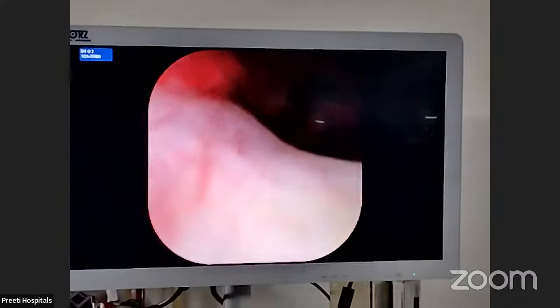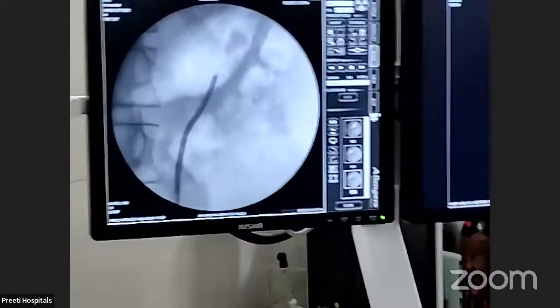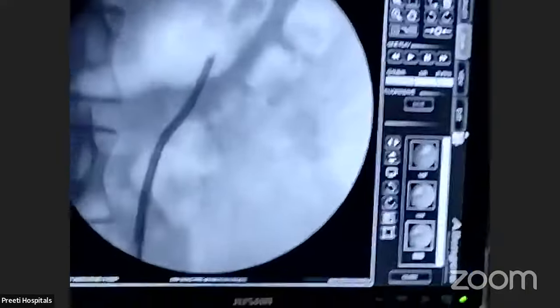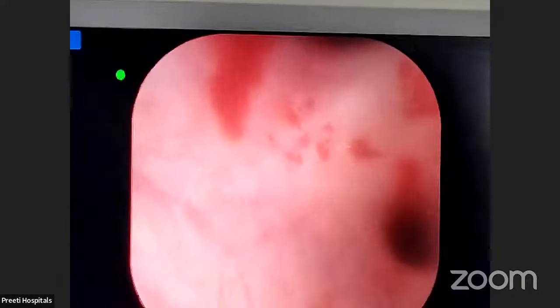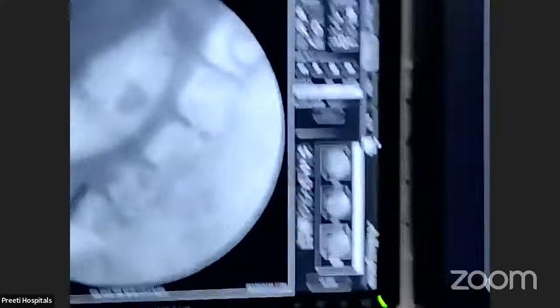Let us see how we can come up. Can you see where I am? If the sheath, where is the sheath? We have to see now. So I am coming back. This is the sheath. If I travel this much extra distance, I can do it. So I will try. Hold it. He is a tall man, even 50 centimeters is becoming short.